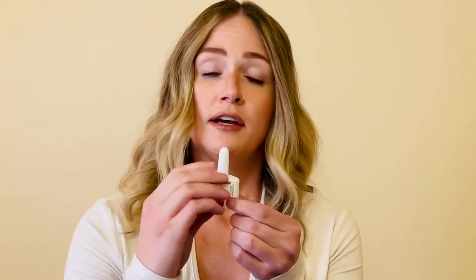First, let's talk about the nasal. Inside the box, there are two doses that look like this. You will simply insert into one nostril and push the plunger. There will be no noise emitted, but you can be assured that if you've pushed the plunger, the dose has been administered.